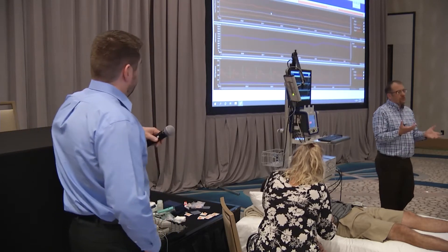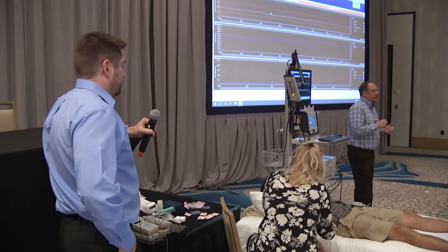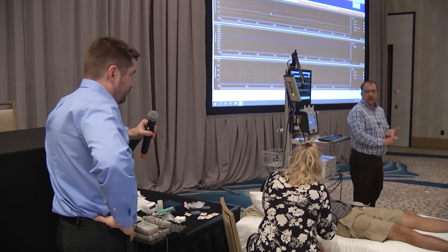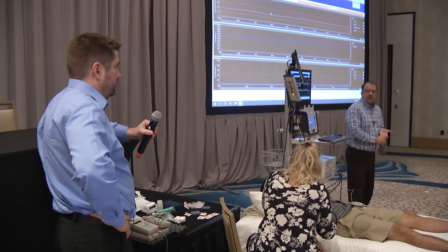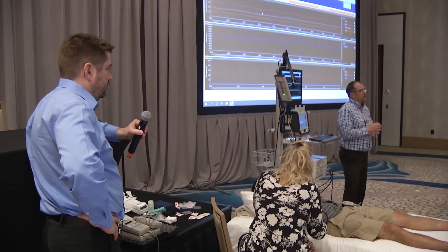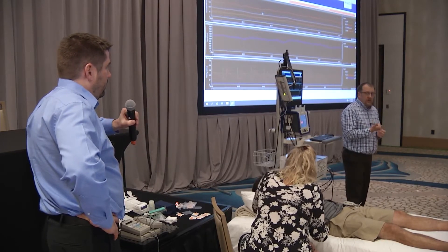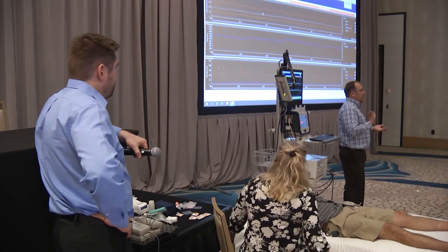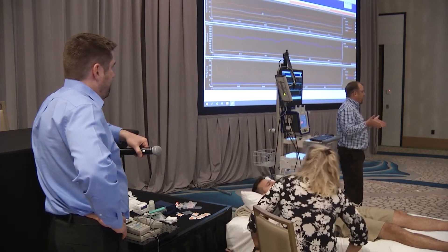Typically, as a guide: orthostatic intolerance would be a ten-minute tilt, as would POTS and anybody under the age of 18. Otherwise most other referrals, unless specifically marked, would just be a five-minute tilt. We normally take blood pressures at one minute and four minutes at baseline.